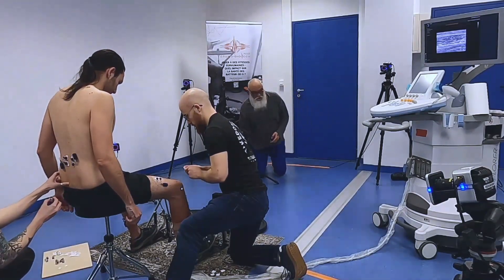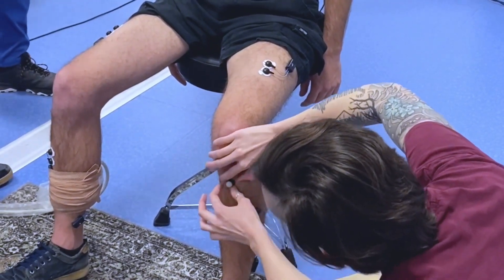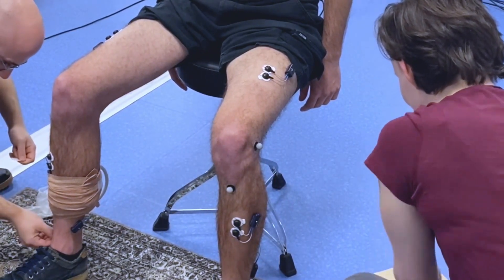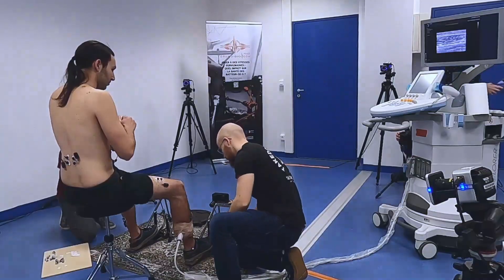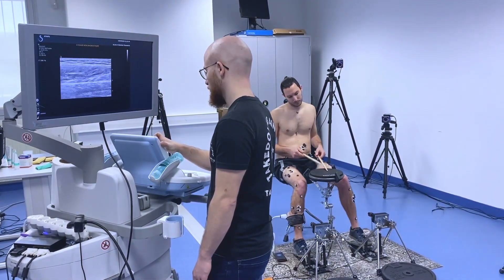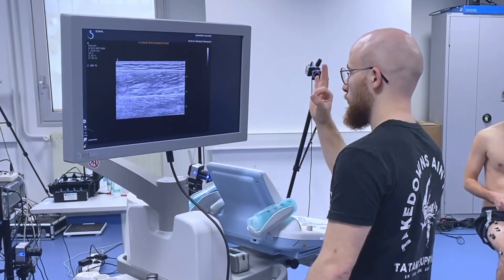The first thing I was shown was how sensors can be used to literally observe the muscle underneath the skin — an internal view of the calf muscle — so we can see what happens from the moment we start playing drums, activating ankles, and see how much the calf is involved. What we see here is a layer of skin, a layer of fat, then the muscle, and you can also see a vein in the middle of the muscle — a truly internal vision of whatever is happening.